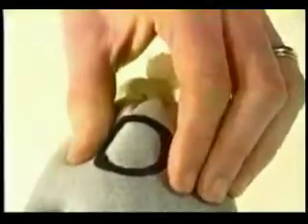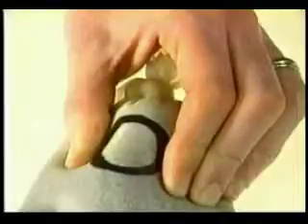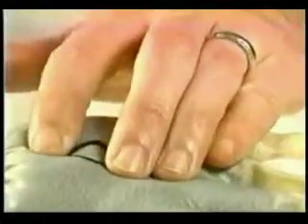In larger targets, three centimeters and up, this can usually be easily done by using the thumb and opposing fingers. However, in smaller targets, it is more effective to use the forefinger and middle finger. Note how close the fingers are to the nodule in order to keep it firmly in place.